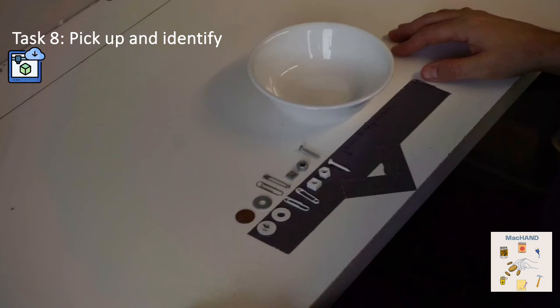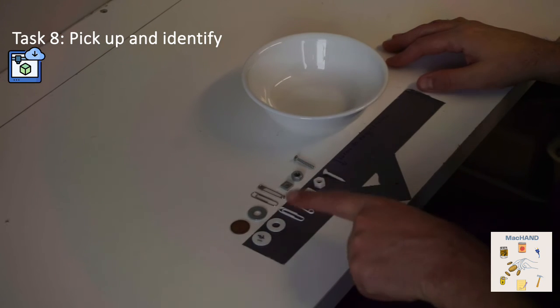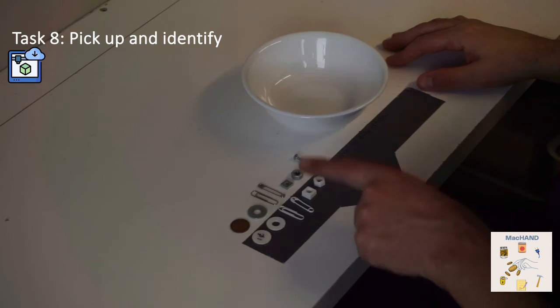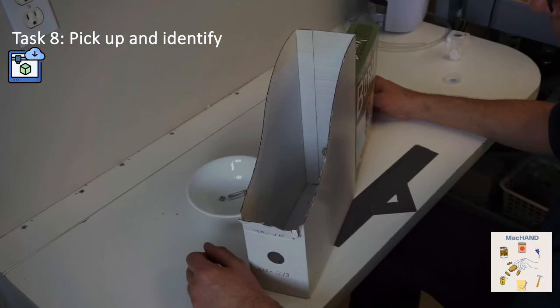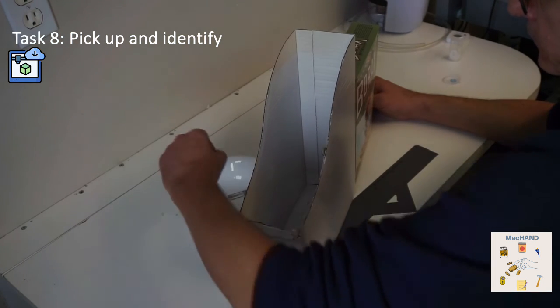For this next task, the different objects are presented to the patient by the assessor to familiarize them with their names. If the person being tested has difficulties with language because of cognitive or linguistic concerns, a second set of objects can be used for the subject to identify by pointing. The patient is then asked to close their eyes and to pick up one object at a time from the bowl and to name it and drop it on the table.